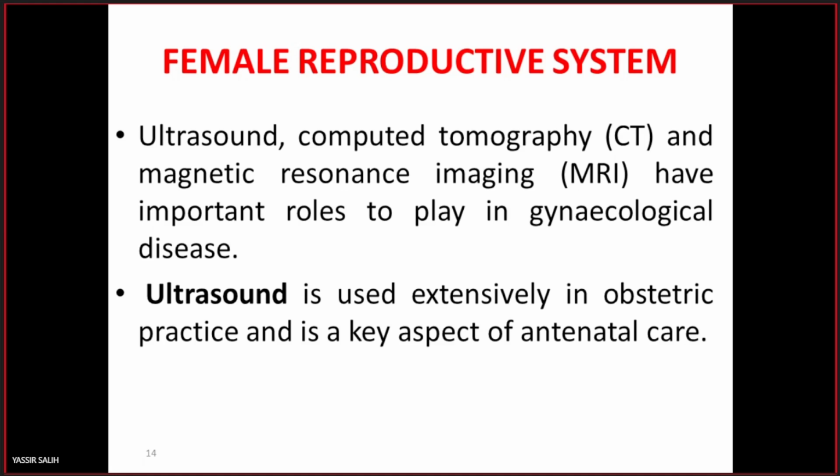Also, ultrasound and CT and MRI have important role in assessment of gynecological disease. يعني احنا دائما بنعمل either ultrasound or CT or MRI.